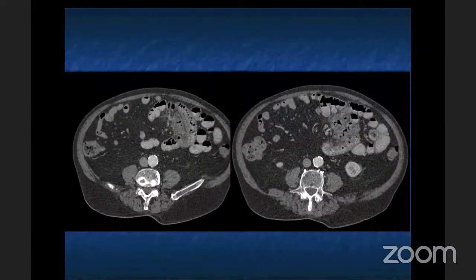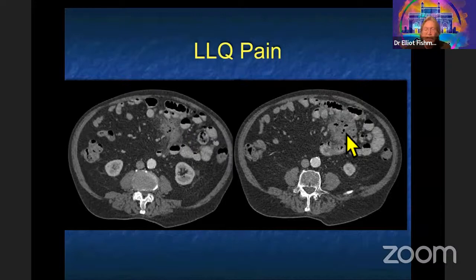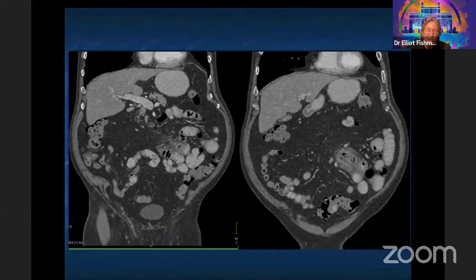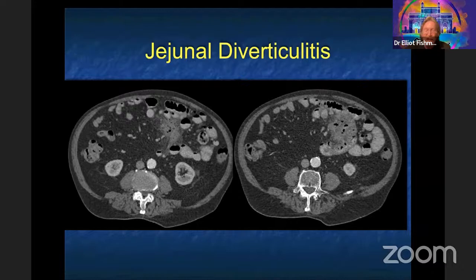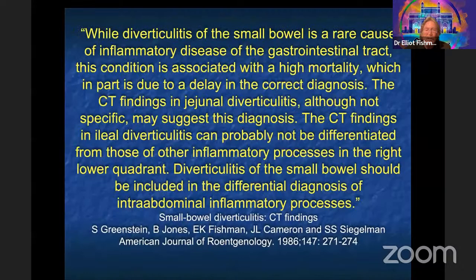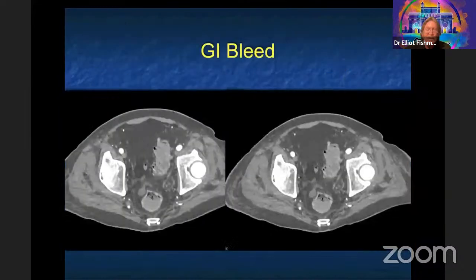Left lower quadrant pain. Answers: carcinoid, diverticulitis, paniculitis. This is coming off the small bowel — it looks like diverticulitis, and in fact it is, but it's not typical colonic diverticulitis. It's small bowel diverticulitis, specifically jejunal diverticulitis, which is far less common. It often looks like a perforation. Patients are typically treated conservatively, so it's an important diagnosis to make.